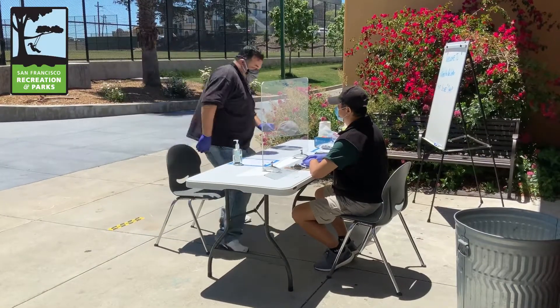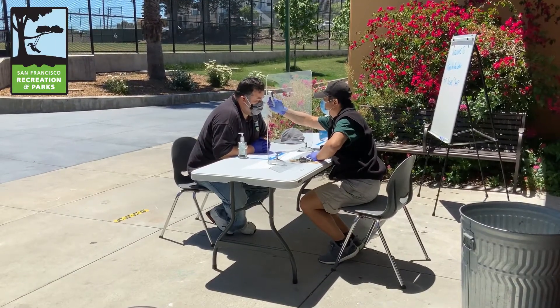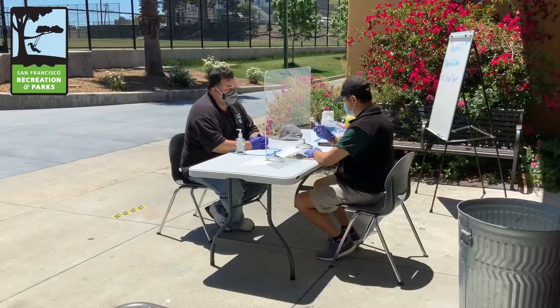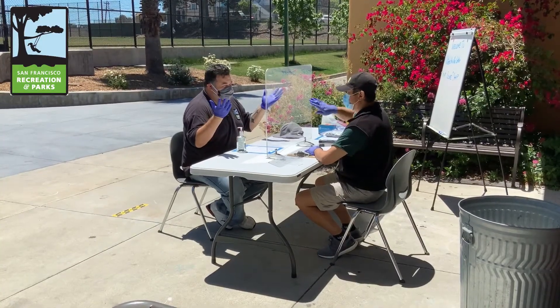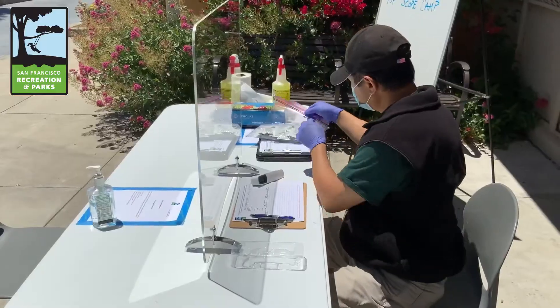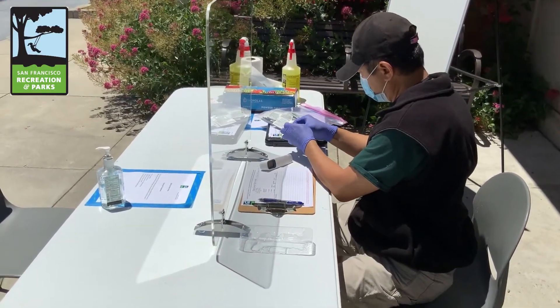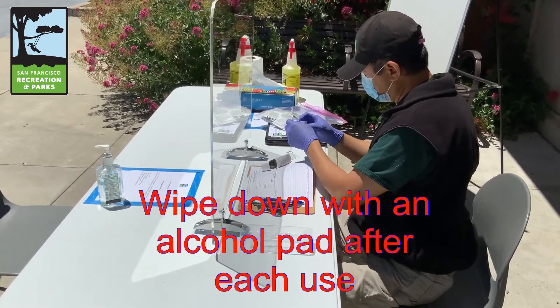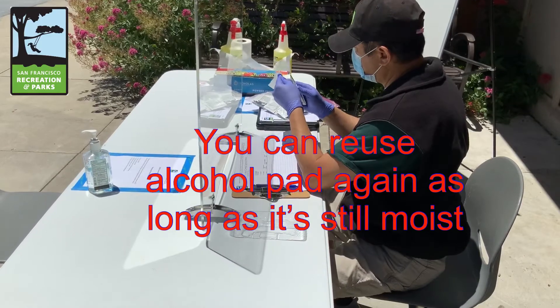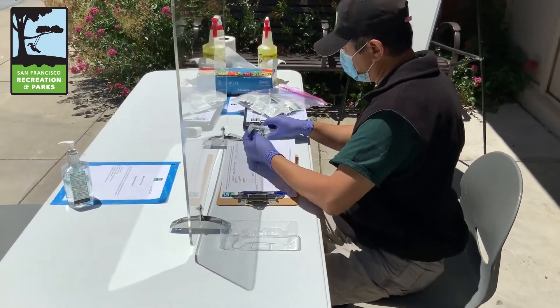Oh, look who's here — it's Jerry! He's not looking too good today. A hundred and two degrees. Sorry, buddy. Maybe next time. Make sure that anyone with a temperature higher than 100 degrees is sent away. After each reading, you should wipe down your temperature taker with an alcohol swab. Make sure you allow some time to dry before using the temperature taker again.